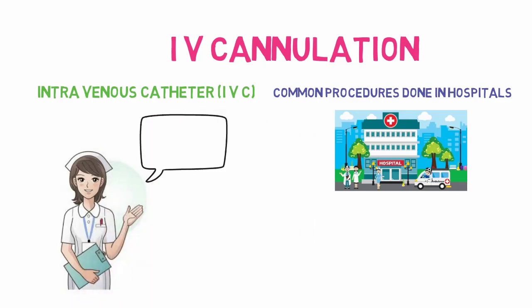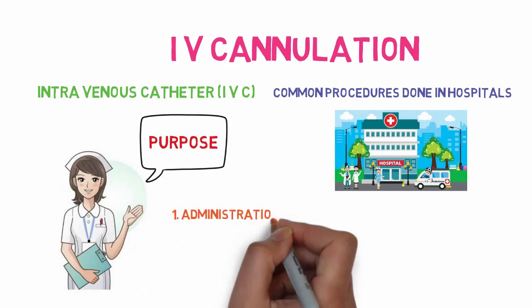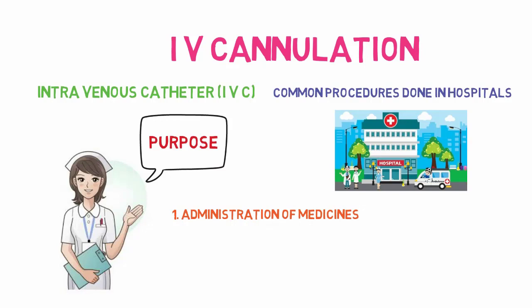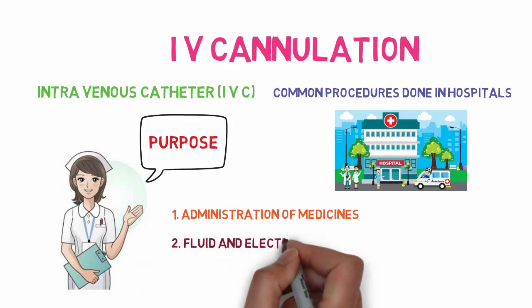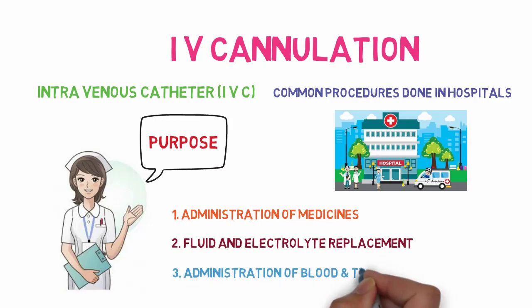Let us begin with the major purposes of IV cannulation. Some of them are: number 1, administration of medicines; number 2, fluid and electrolyte replacement; number 3, administration of blood or blood products and total parenteral nutrition.